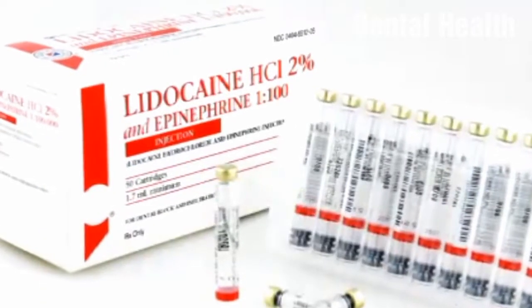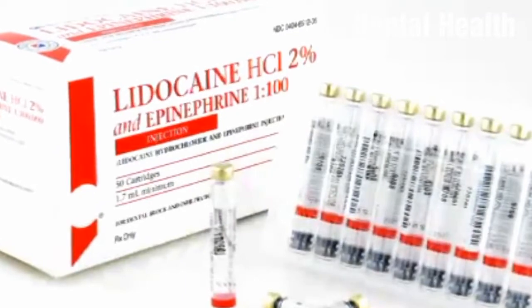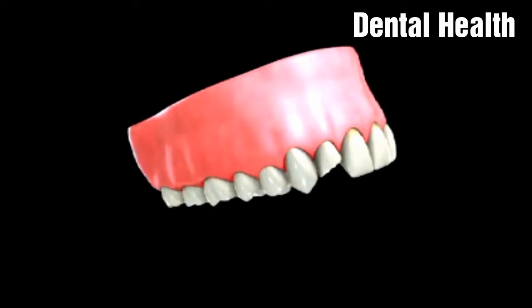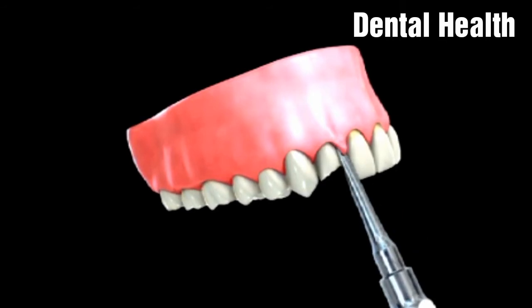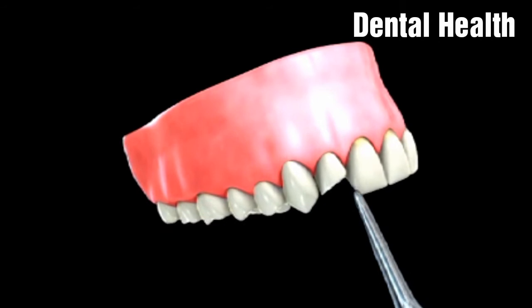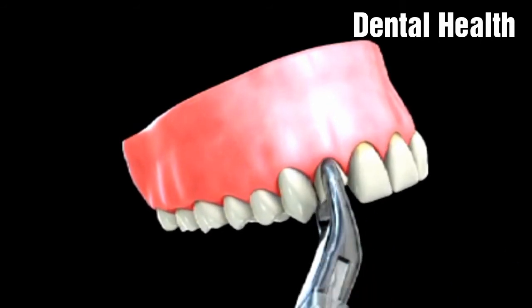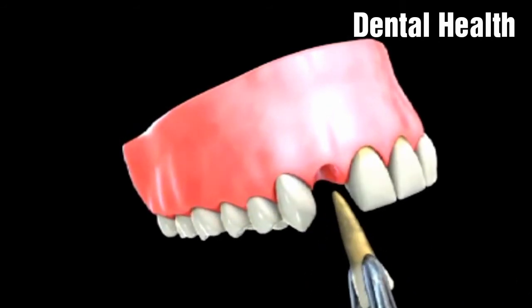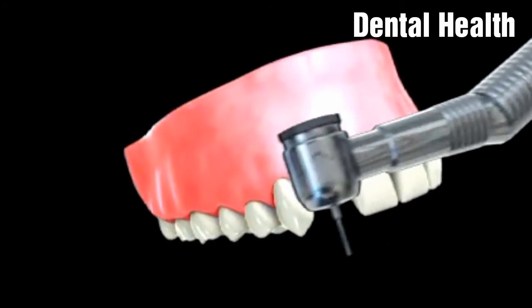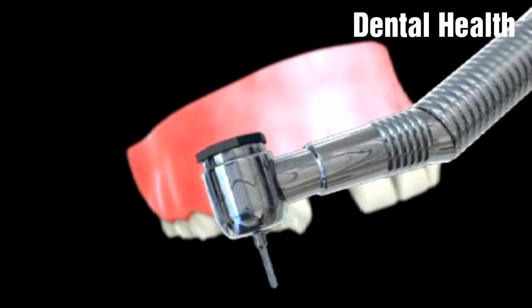First, a local anesthetic is applied to make the procedure more comfortable. In some cases, your dentist will elect to use nitrous oxide gas in addition to the anesthetic. Once the area is numb, the extraction begins. A dental instrument, called an elevator, is used to wiggle the tooth in its socket. After the tooth is loosened, it is removed using forceps, or in some more complicated cases, a surgical handpiece is also used to assist with the removal of the tooth.